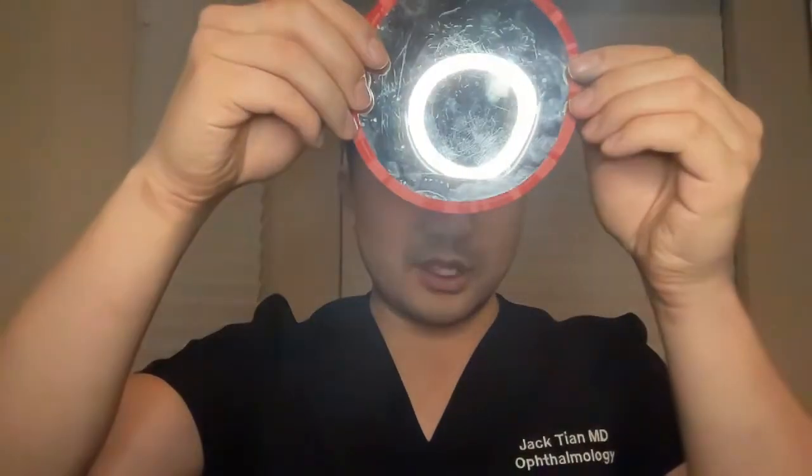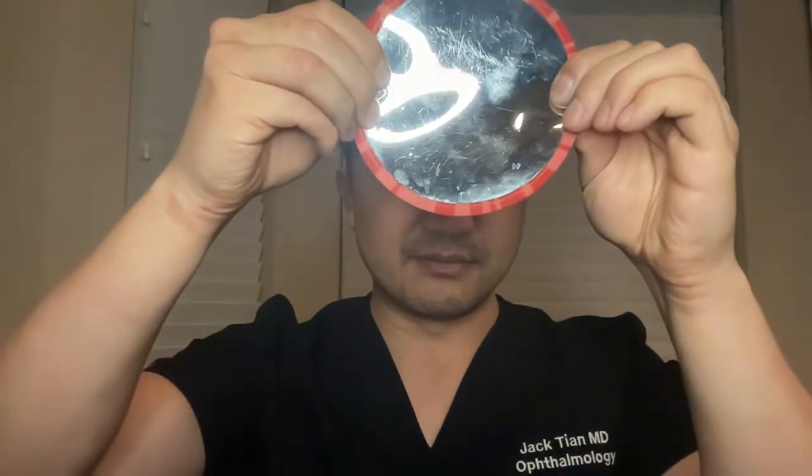And sometimes we have higher order aberrations and we will end up with other shapes. For regular astigmatism — the oval shapes — we can use a toric lens that has a power built into it to counteract your astigmatism.